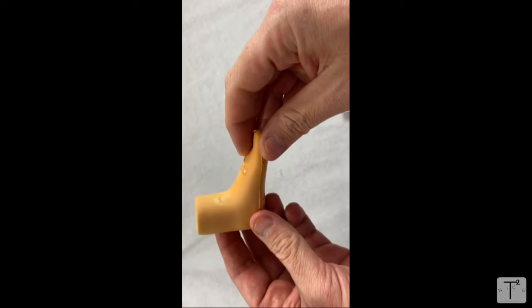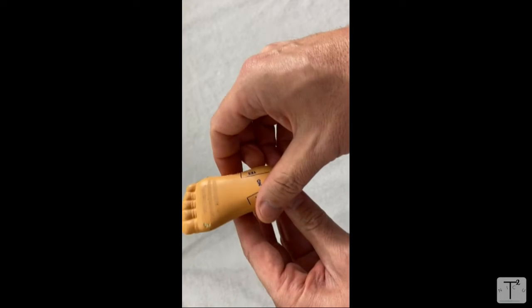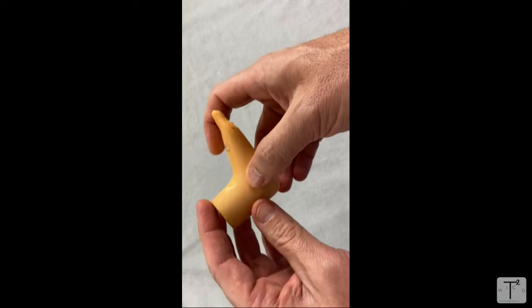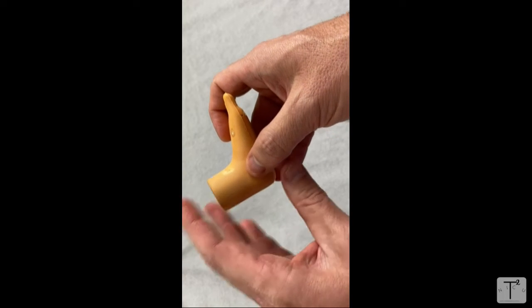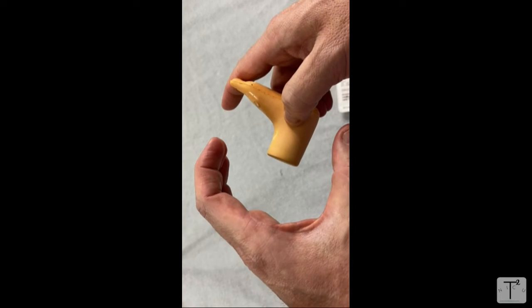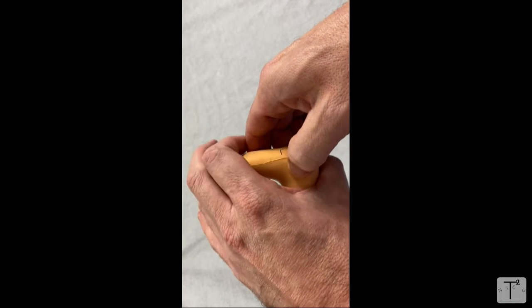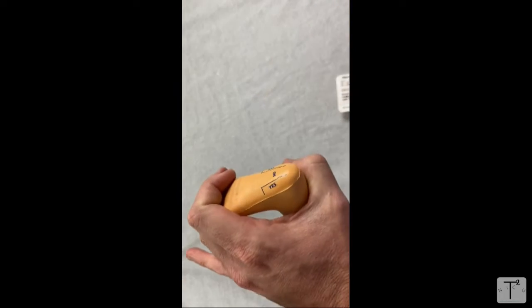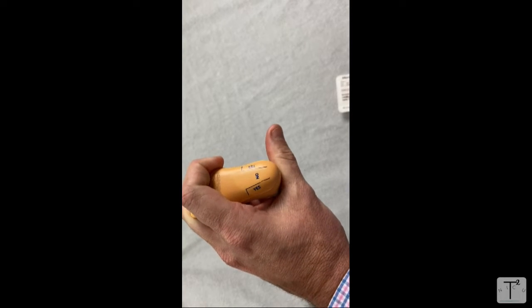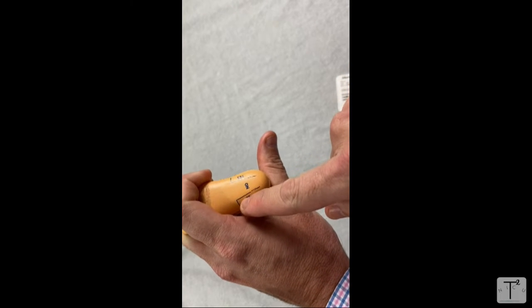Okay guys, here's my foot — this is actually a pretty scale model of a premature baby's foot, and of course they come in smaller sizes. The first thing I'm going to show you is how to place your hands. I normally teach people to get a C-grip. Here's your C. The next thing you're going to do is take that C and go like this. Here are your line marks — we always want to go on the sides. It's best to stick up a little bit higher so that as the blood drips down the heel, you can capture that drip right there.